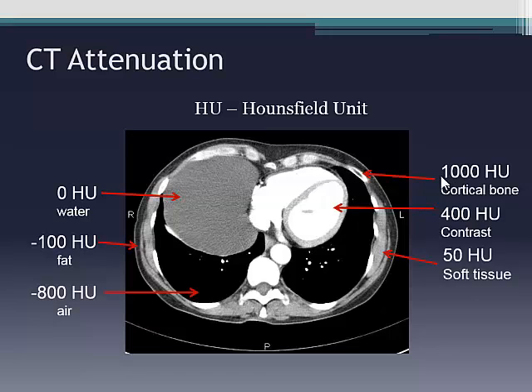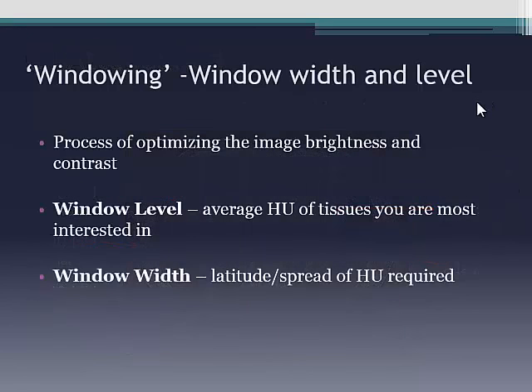In the same way that it's very good at looking at fat, it's also very good at looking at bone. Think about what we do for trauma, we always do a CT because CT is so sensitive for identifying calcification. In other words, you can use that to your advantage. For example, when you're looking at pericardial disease, you often do a CT and an MRI. The point is, with all of these techniques, what we're trying to do is teach you a multimodality approach and what the strengths of each technique are and how they can work in synergy with one another to help you solve clinical problems. Because that's effectively what they are. They're tools to help you solve a clinical problem.